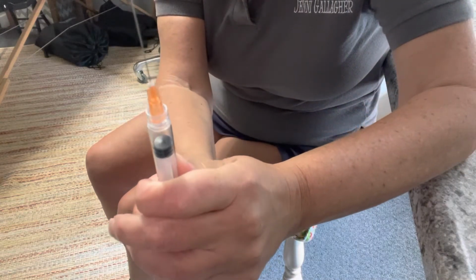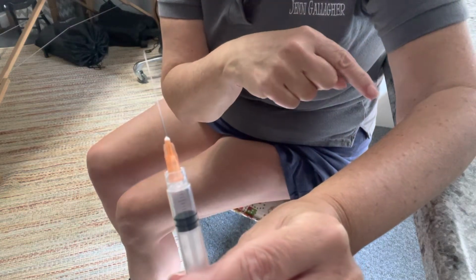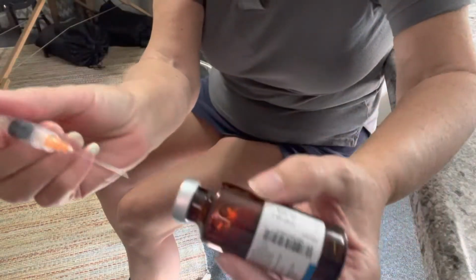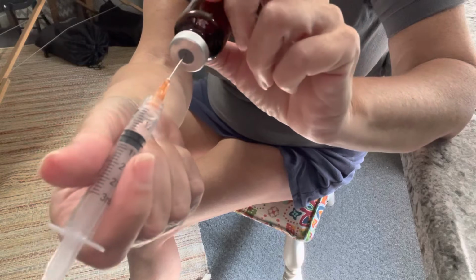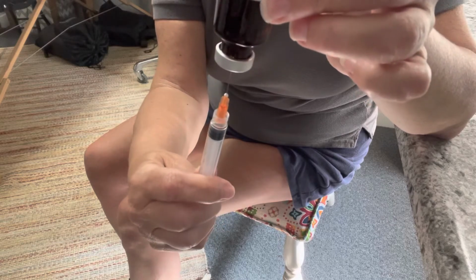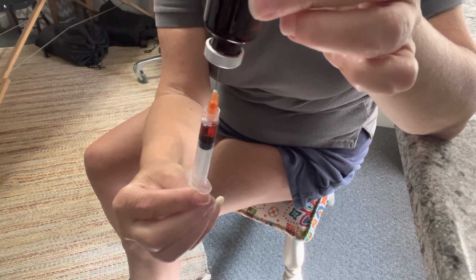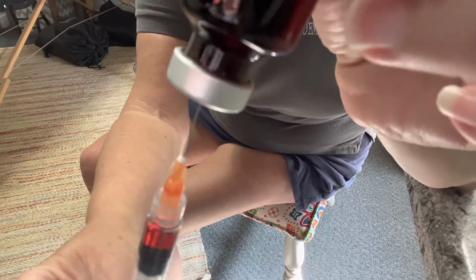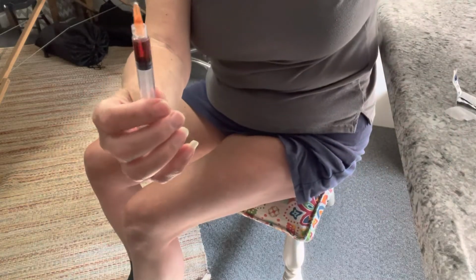So we're going to take our cap off of the needle, and we're going to pull a little bit of air into our syringe. That's about 1 ml, which is what I'm taking out of the medicine bottle, so I want to put in that same amount of air. Now I'm going to press the needle into the little gray center part. I'm going to inject air, and then I'm going to pull out the 1 milliliter of medicine. So you can see real close that I've got my 1 ml of medicine in. There is a little air bubble. I'll show you my trick for that.